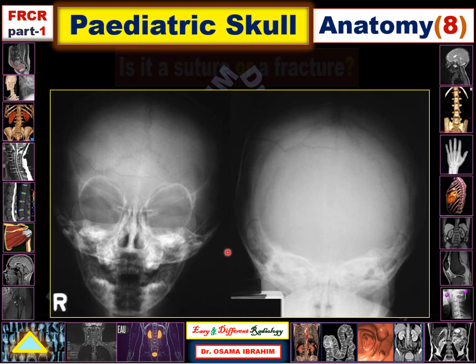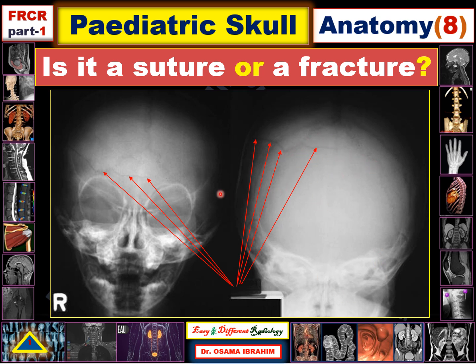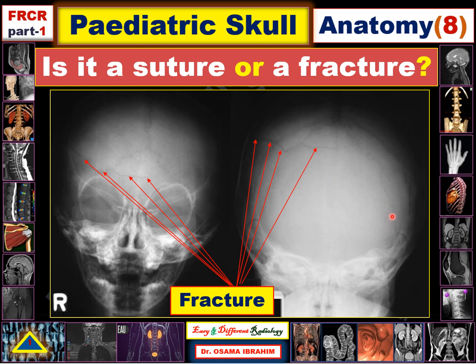Now for the question of the presentation: is it a suture or a fracture? There are lucent lines extending through the occipital bone in this Towne's view, and also extending into the parietal bone. This location is not the expected normal site for sutures. Therefore, this is considered a fracture. By knowing the normal suture locations, you can discriminate between a fracture and a suture.